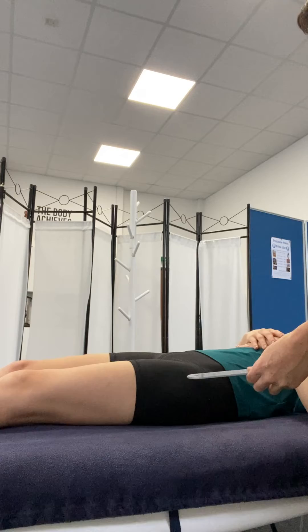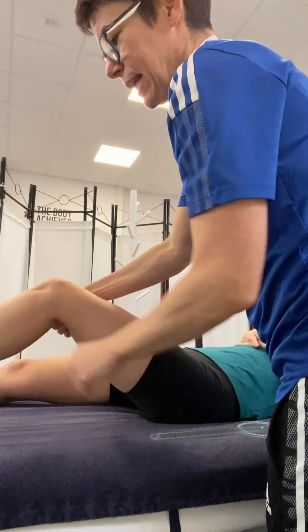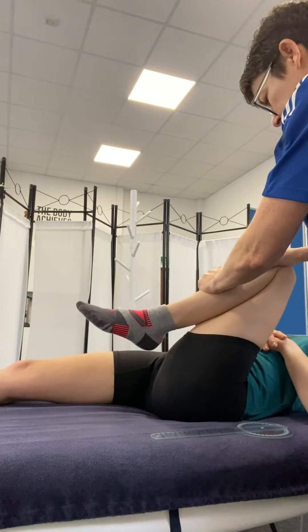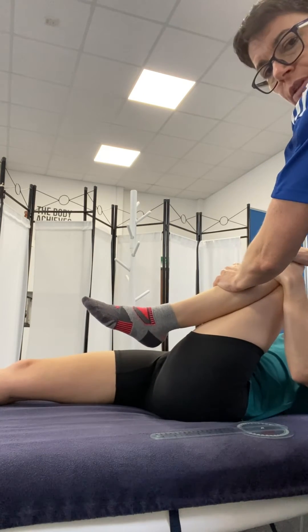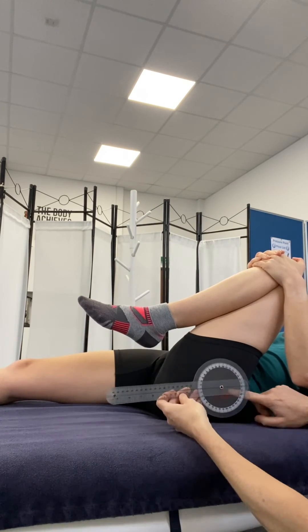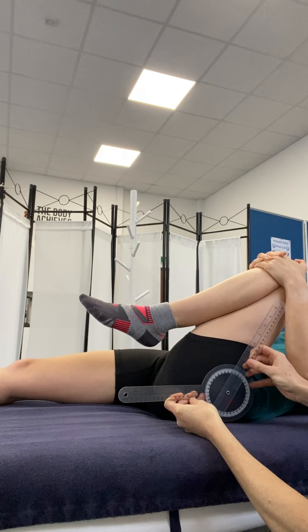The other measurement is hip flexion with knee flexion. This takes the hamstrings out of the equation. We take them to a point of resistance, then the client holds their knee to hold that position, and now you have two hands to do the measurement. Exactly the same point from the greater trochanter, and we take it round to that lateral knee joint line.